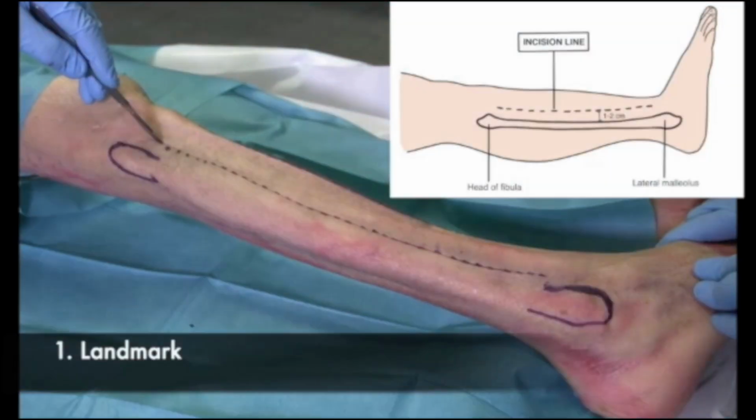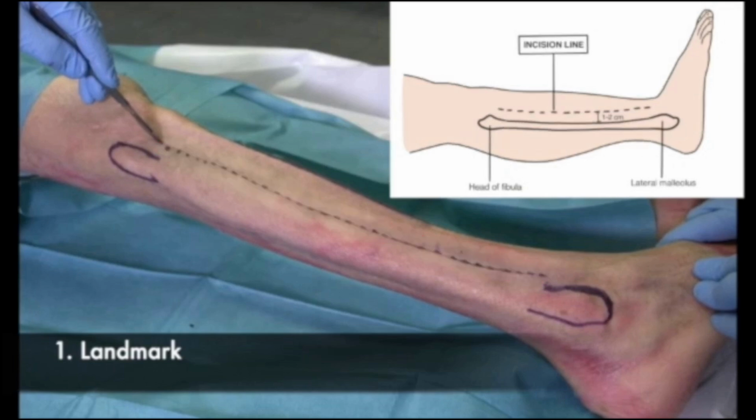To landmark, find the lateral malleolus and head of the fibula. Draw a line between the two. Then, draw a punctuated line 1 to 2 centimeters anterior to the line of the fibula. The punctuated line is the incision landmark.